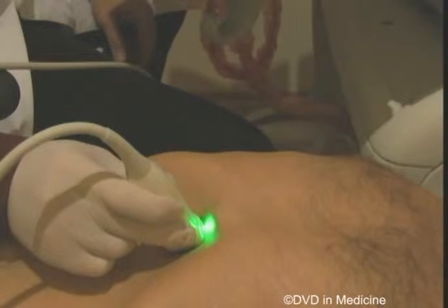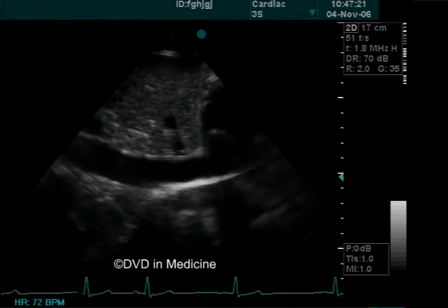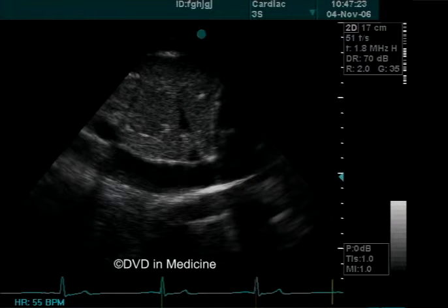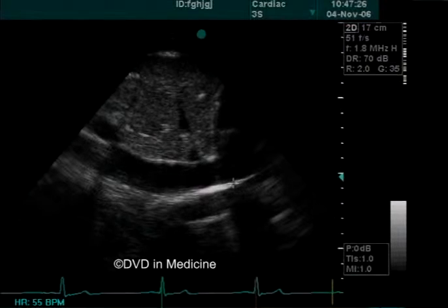One should place the transducer in the epigastric region and angle the scanning plane sagittally on the middle line and then tilt it a little to the right. Inferior vena cava is seen posteriorly to the liver. One can see the place where the inferior vena cava connects with the right atrium and sometimes the valve at this junction.